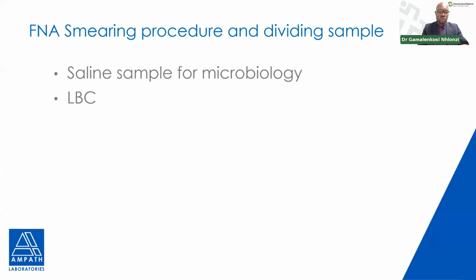And if you are doing LBC, instead of putting all your sample on the slide, you may put a few on the slide and then take the rest of the tissue and put it in an LBC sample. So that means that in the lab, once they get it, it is fixed. It should be centrifuged to get a sediment and produce cytology tissue blocks for histological assessment as well.